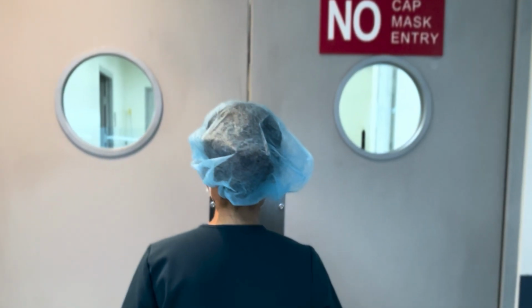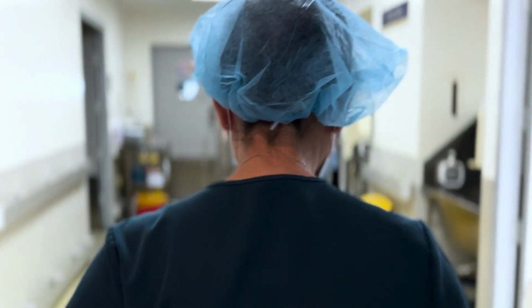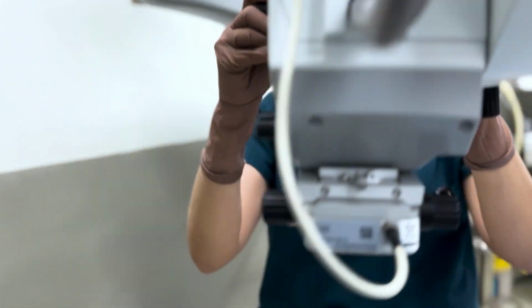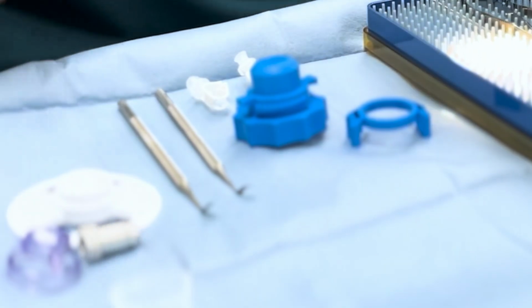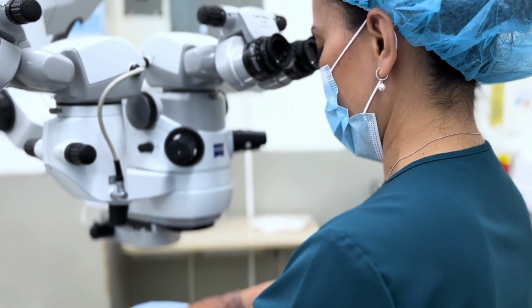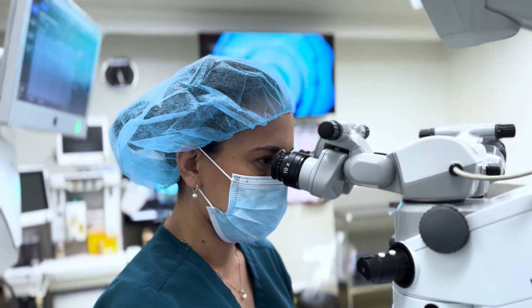Descemet stripping endothelial keratoplasty, or DSEK, replaces diseased corneal endothelial tissue with a thin donor graft of posterior corneal stroma, Descemet's membrane, and endothelium. The graft tissue can be prepared either manually or automatically using a microkeratome. The use of an automated microkeratome facilitates donor preparation, however, it will add to the cost of surgery. In this video, I will show you a technique of donor lenticle preparation for manual DSEK.